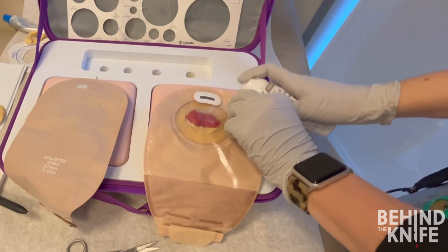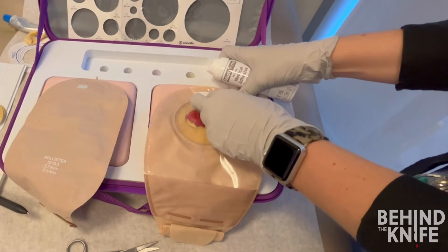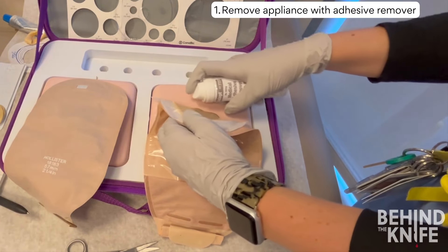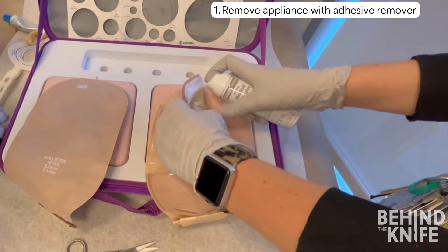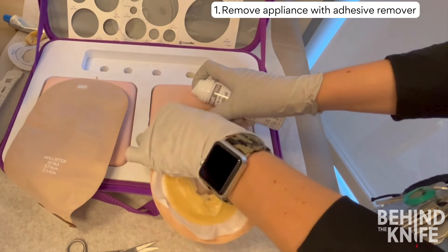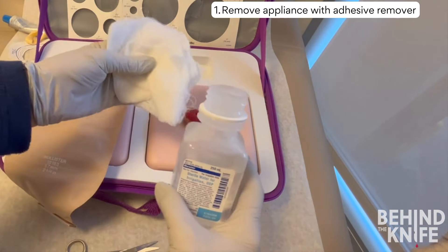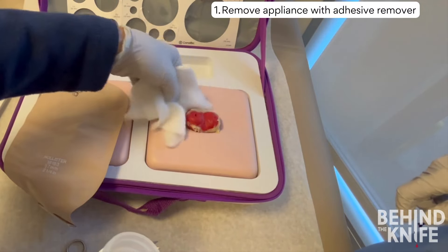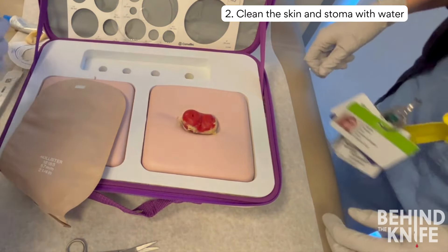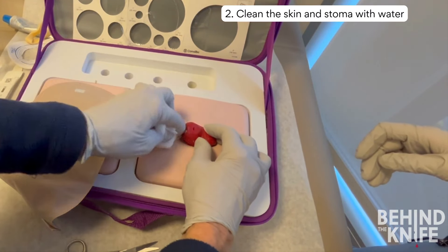Now let's discuss how to change an ostomy appliance. You should start by removing the old appliance. Ostomy appliances can be really sticky, especially if the patient is using an ostomy paste. It is best to use an adhesive remover to help gently remove the appliance from the skin. You should avoid using alcohol pads and hand sanitizer — while these can help break down the adhesive, they can also damage the mucosa of the ostomy. Once the appliance has been removed, you can clean the skin and stoma with a wet gauze.